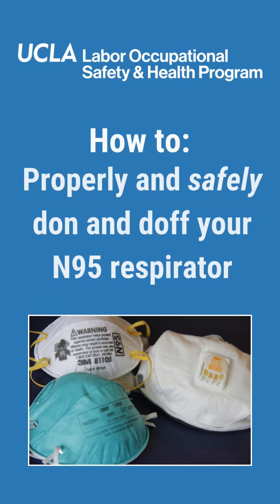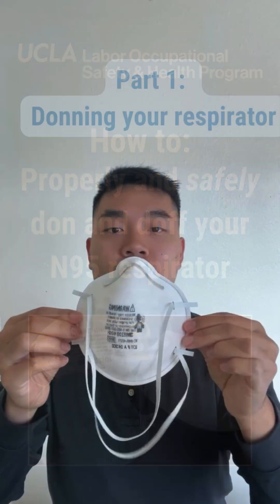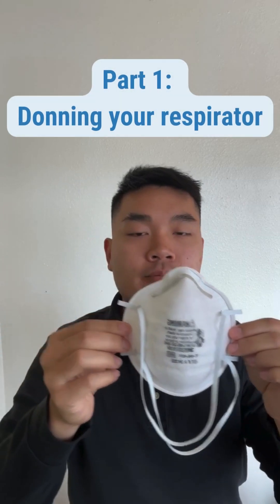How to properly and safely don and doff your N95 respirator. Part 1: Donning your respirator.